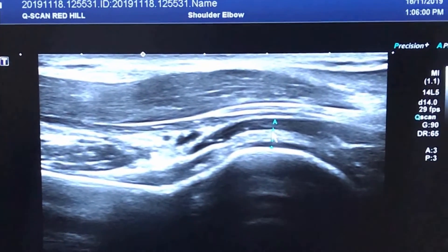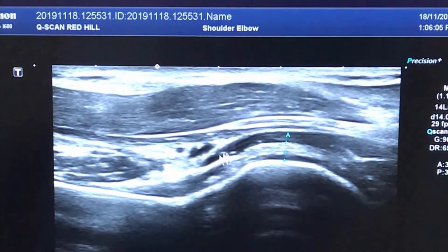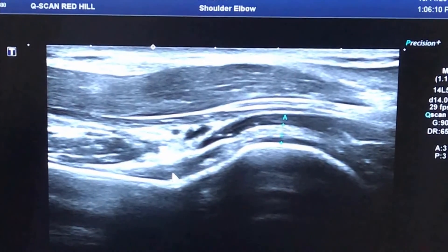From there to there — that's the inferior glenohumeral ligament that we would measure. And you can also see down here a little bit of the inferior glenoid recess.